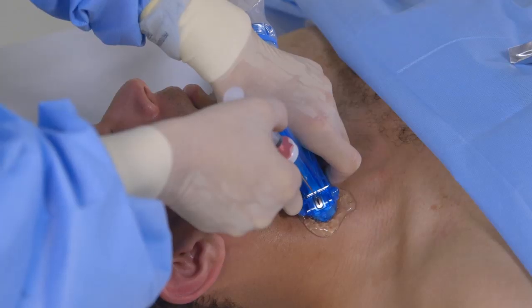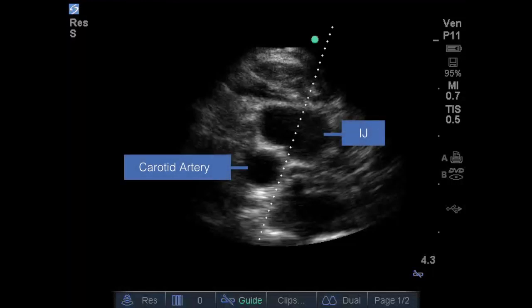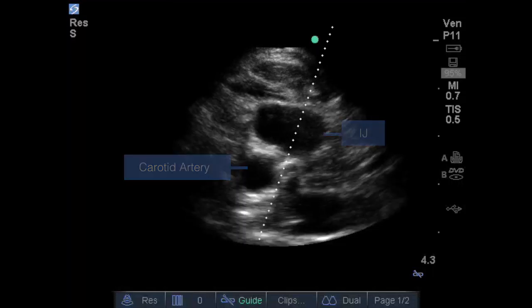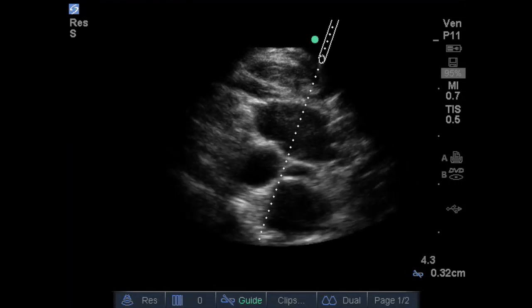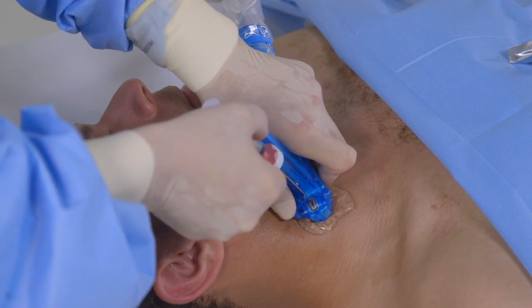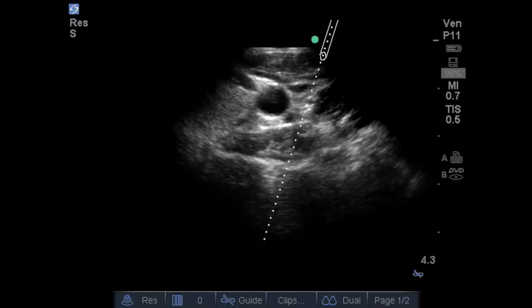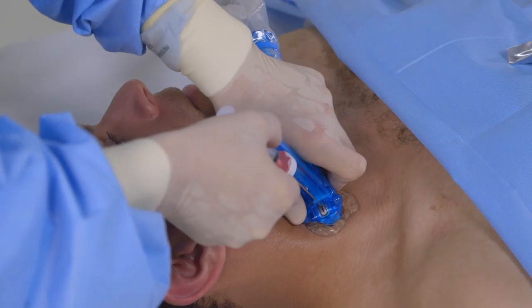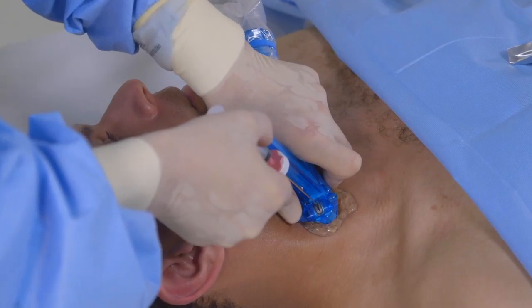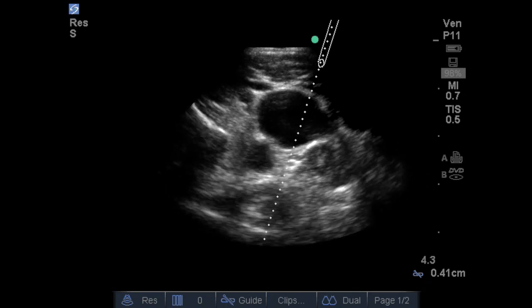Here's a look at a sonogram from an actual procedure. The needle tip has been secured inside the sterile shield by continuous gentle pressure on the needle clamp during the scanning process. The on-screen target line is aligned with the internal jugular vein and the probe is angled about 30 degrees downstream. The needle clamp is then released and the needle advanced until it penetrates the skin. Remember, it may be necessary to add pressure with the probe until the skin is penetrated by the needle to prevent image loss. Notice that the extra pressure causes the vein to flatten out. Once the skin has been penetrated, the extra pressure applied with the probe is relieved and the vein refills and is visible. The target line is confirmed to still be located at the desired position on the vein.